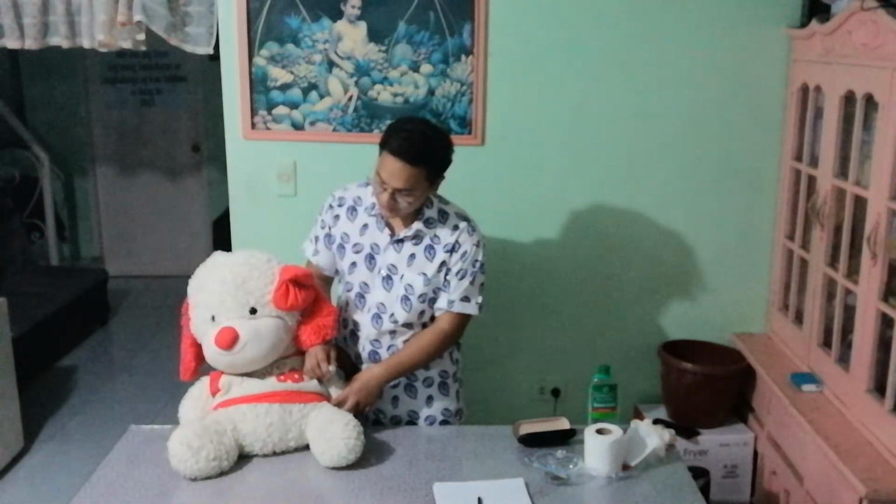Number five, we need to hold the thermometer in place until we hear a beep. So assuming we have already heard the beep, we need to remove the thermometer carefully. Ma'am, I will now remove the thermometer.